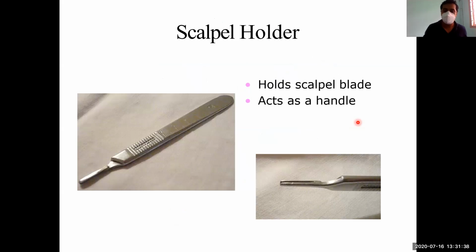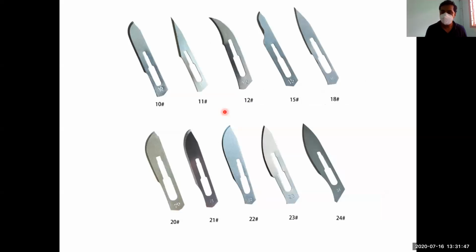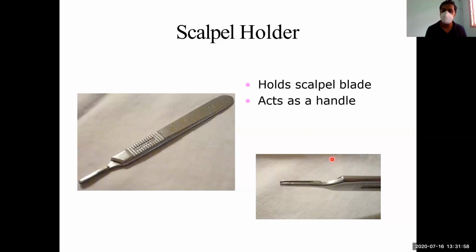Knife handle, scalpel holder or handle. This also comes in various sizes. We have seen the smaller size and larger size blades. Now we cannot hold those blades with our hand. It is risky. We can injure our fingers also. So we will use it as a handle, so that there will be sharp control while using the blade. Okay.